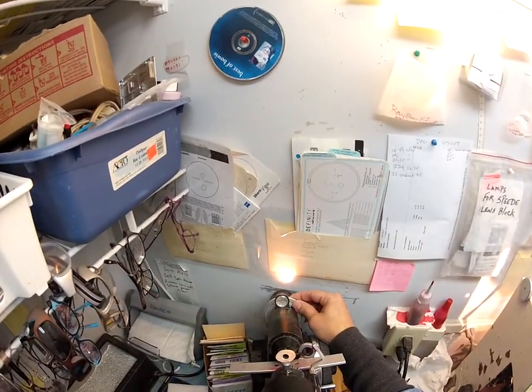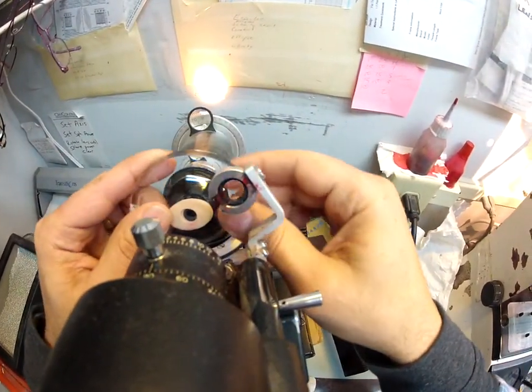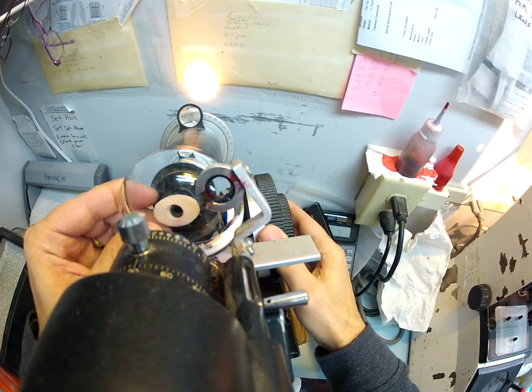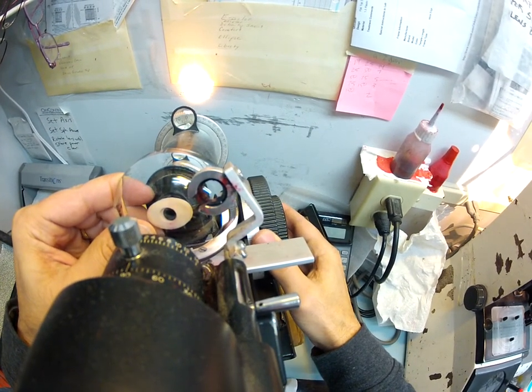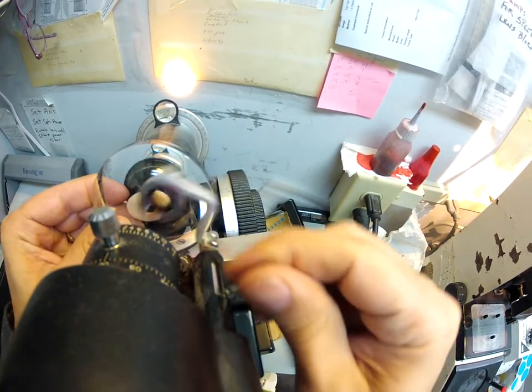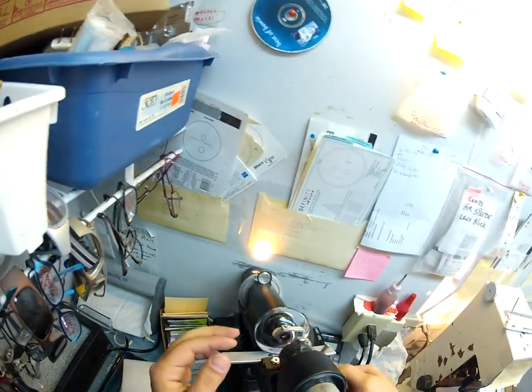Your prescription is minus 6.50 minus a quarter at one. Let's turn that to minus 6.50 and rotate this in my Marco 101 lensometer. There we go. Let's get the sphere lines right. Find the optical center. I'm just very particular since I do my own lab work.